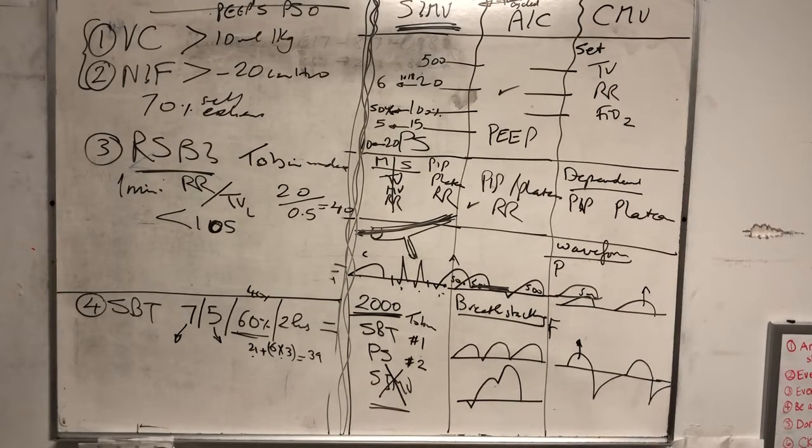So somebody will say, when I go to another hospital, somebody will tell me, Dr. Saror, I have the patient on 3/5, no tube resistance compensation, 3/5 for 5 hours, doing great. Been doing this all morning, 5 hours. I said, okay, thank you very much, but please put him back on the vent because I'm not extubating him now. That's the worst time to add more stress for extubation, right? So 2 hours, you have to make a decision in 2 hours.